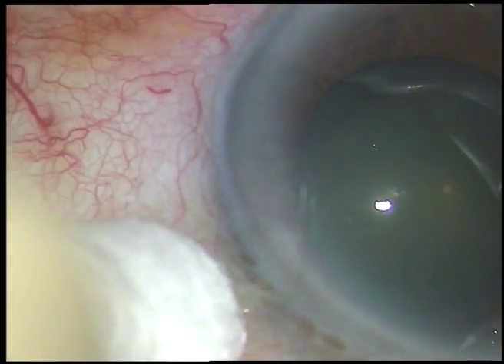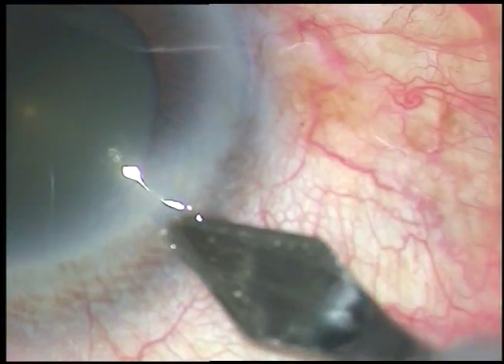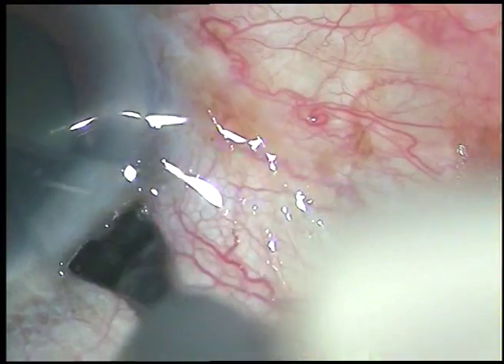Dear colleagues, this is a cataract with nuclear sclerosis grade 2 and the pupil has dilated this much. It is a poorly dilated pupil. I have taken up this case for surgery. Let us watch these surgical steps.